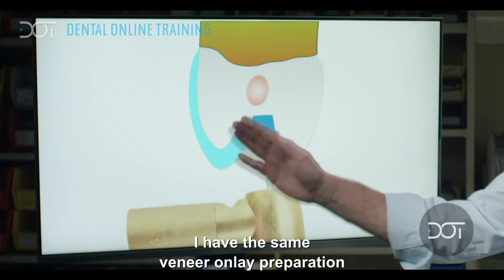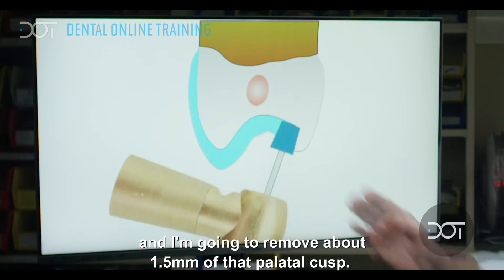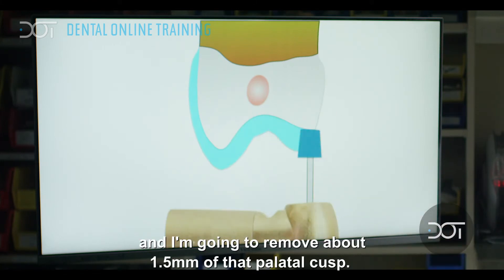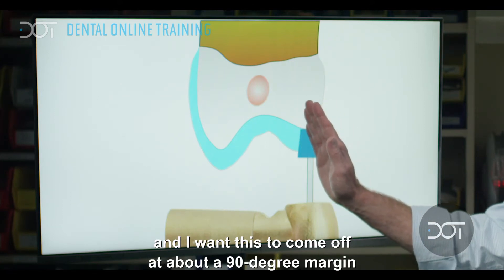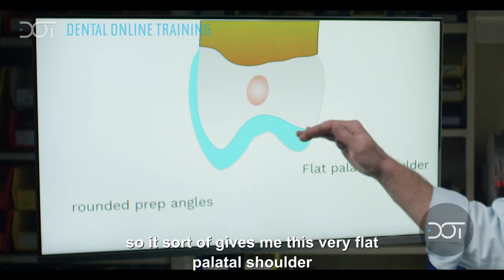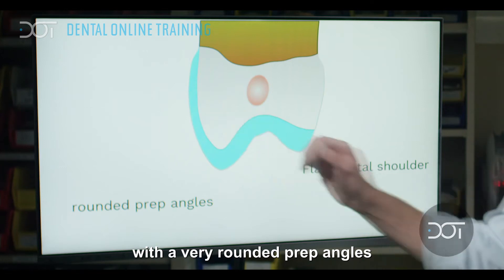I have the same veneer onlay preparation. The difference is I'm going to continue my burr and remove about a millimeter and a half of that palatal cusp. I want this to come off at about a 90-degree margin and slightly heading into the mouth, which gives me a very flat palatal shoulder with very rounded prep angles.